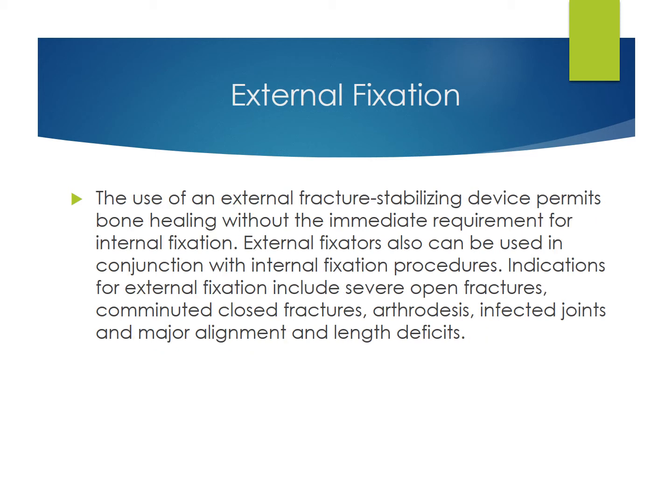External fixation. The use of an external fracture stabilizing device permits bone healing without immediate requirement for internal fixation. External fixators also can be used in conjunction with internal fixation procedures. Indications for external fixation include severe open fractures, comminuted closed fractures, arthrodesis, infected joints, and major alignment and length deficits.